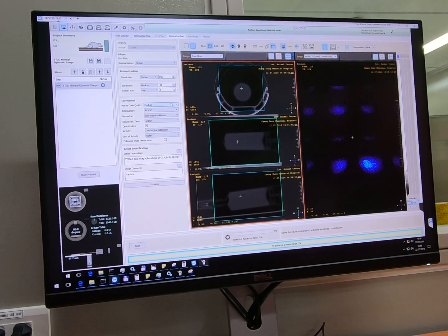So what it does is it considers that some portion of the photons can fly through the aperture itself, so not the holes, but the material itself, and this is just a feature which corrects this effect.